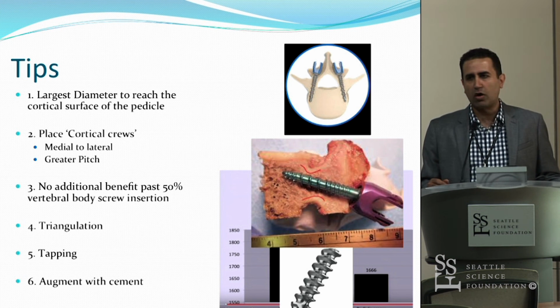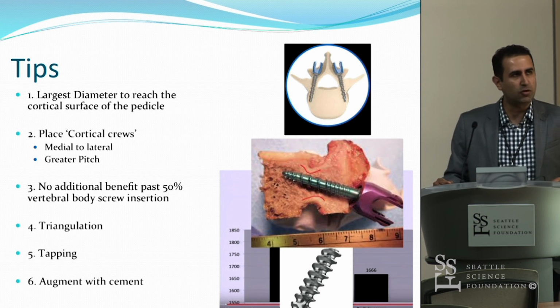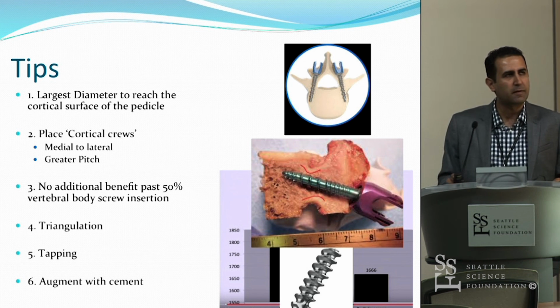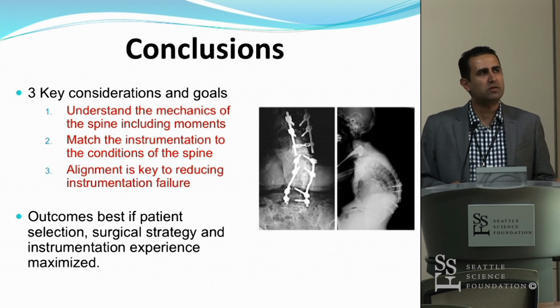And of course, you can augment your screw with cement, and that may lead to a better option in certain conditions, such as osteoporosis.